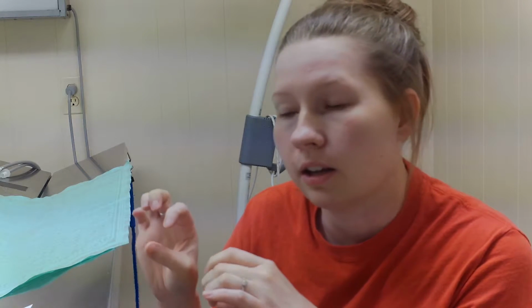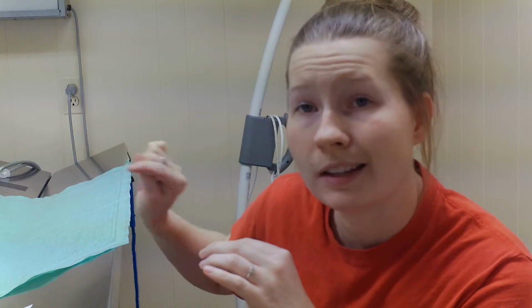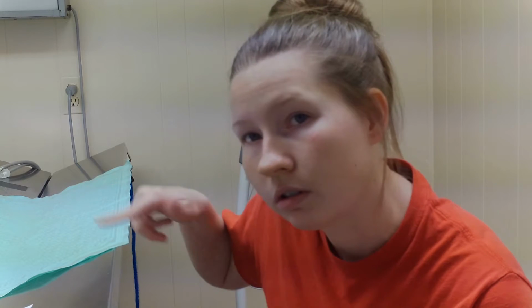So with the intake of oxygen, that's the pulse oximeter, and then the output of carbon dioxide, that's the capnograph. We don't have a capnograph. We did not have one available to us to borrow, but as I stated before, it would be placed between the endotracheal tube and the anesthesia machine tube, or the inhale-exhale tubing, straight to the anesthetic machine. It helps measure the CO2 output as well as the respiratory rate.